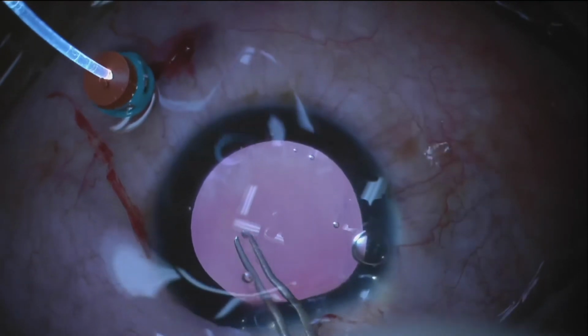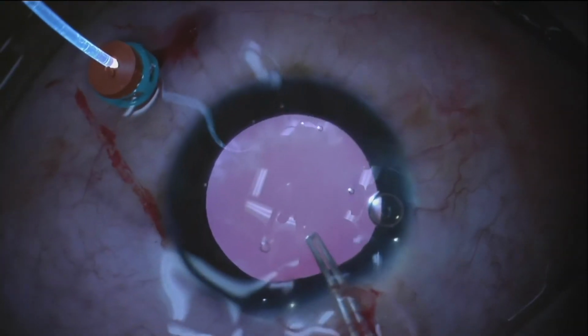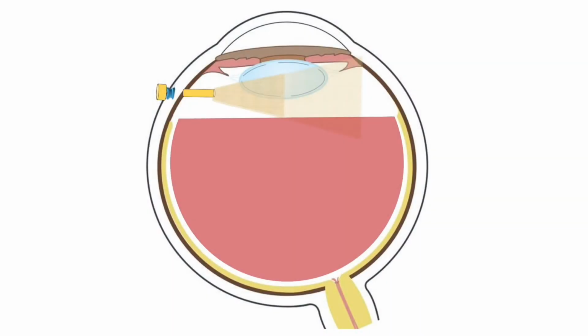Also note that the view is often improved by switching the microscope and room lights off and depending solely on the retroillumination. Next, we will demonstrate the view that is achieved by directing the chandelier horizontally or towards the lens.